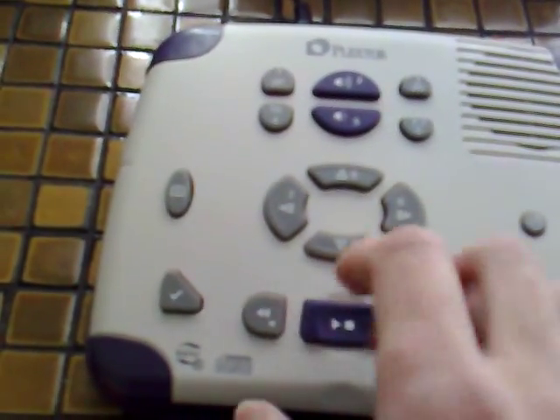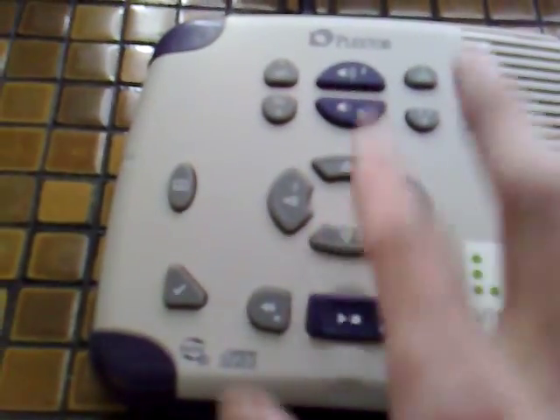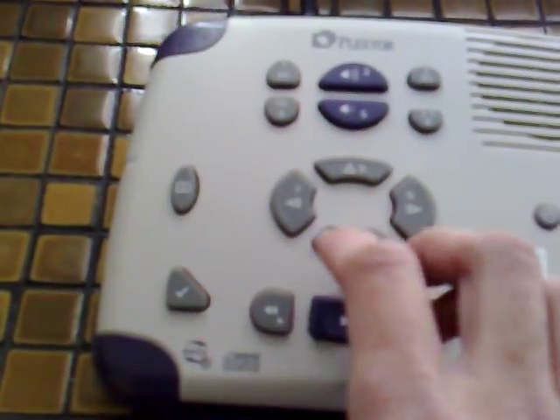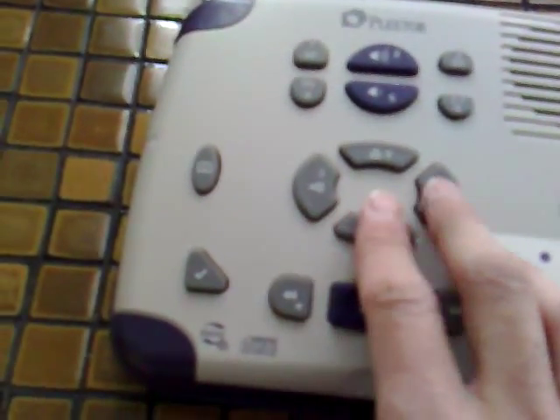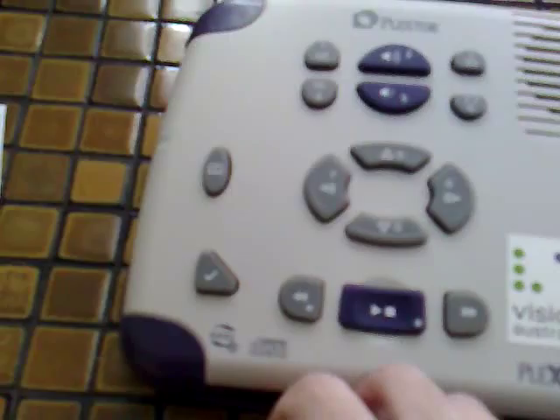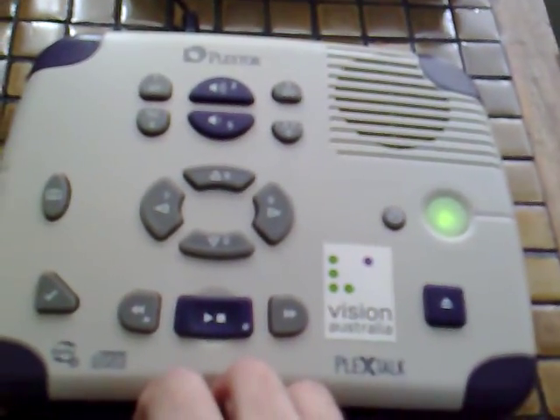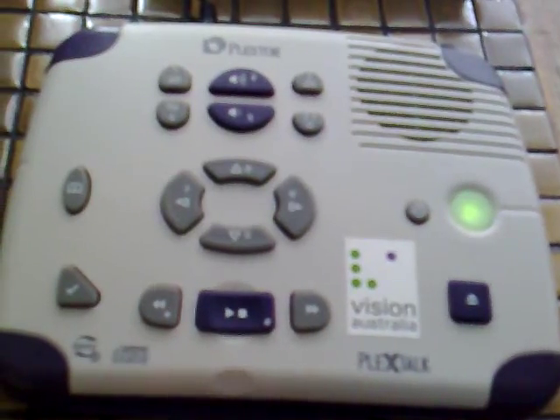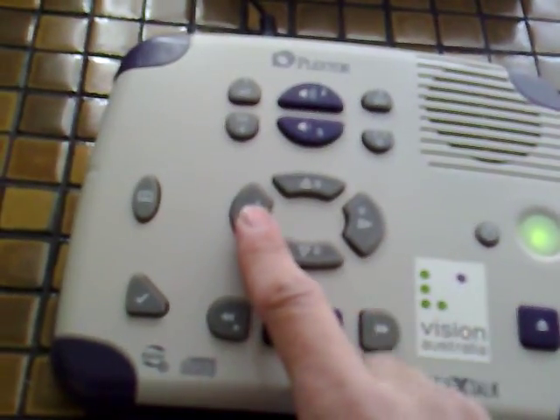Continuing to cycle through the navigation options gives us "time" — you can jump by one minute and ten minute intervals — and then "beginning or end", which allows you to quickly jump to the beginning or to the end of the book. Because this is a CD sampler, there are six titles on this disc, so we can move back to the previous title by pressing the left arrow.